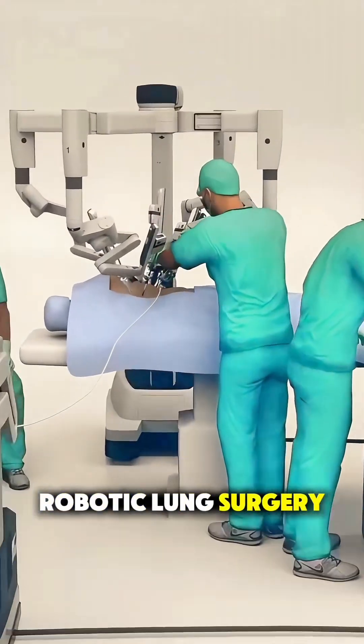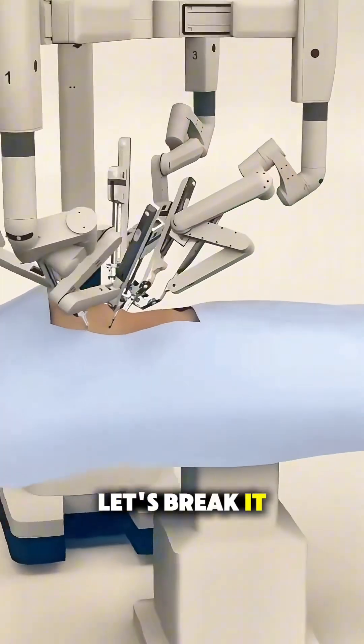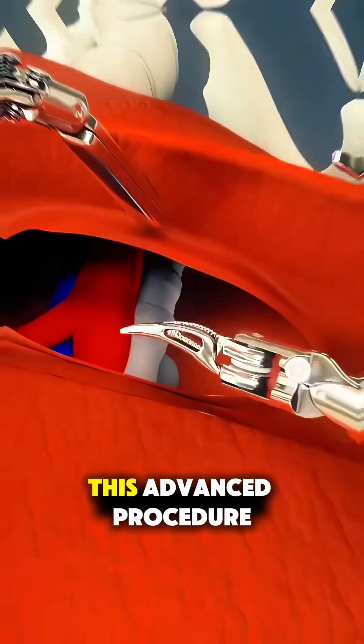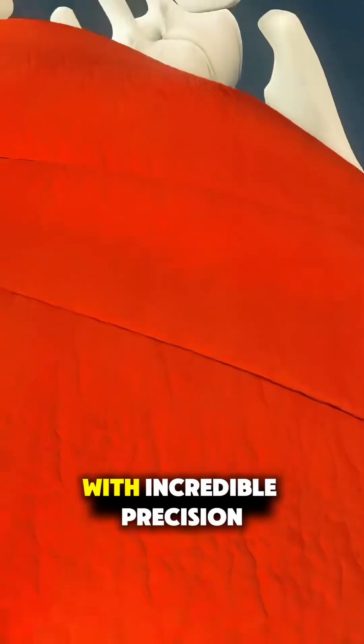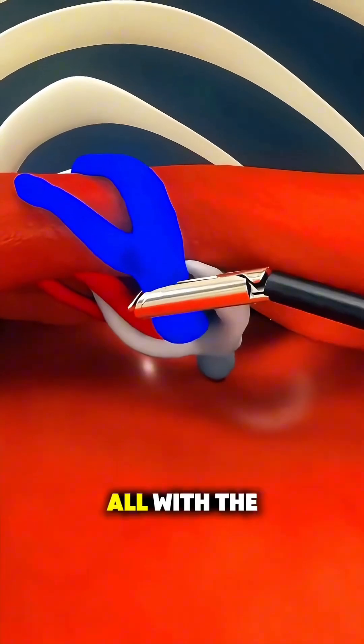Ever wondered how robotic lung surgery is performed? Let's break it down in just over a minute. This advanced procedure is used to remove lung tumors or diseased tissue with incredible precision, all with the help of robotic technology.